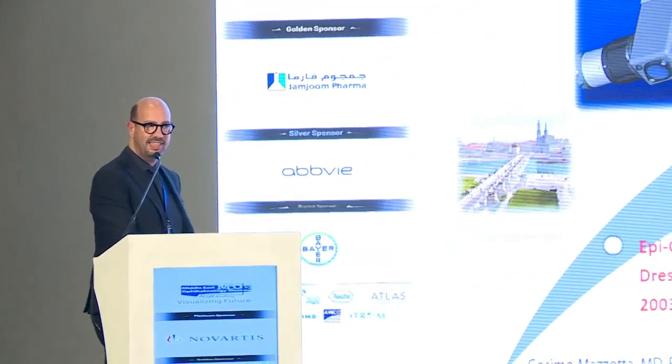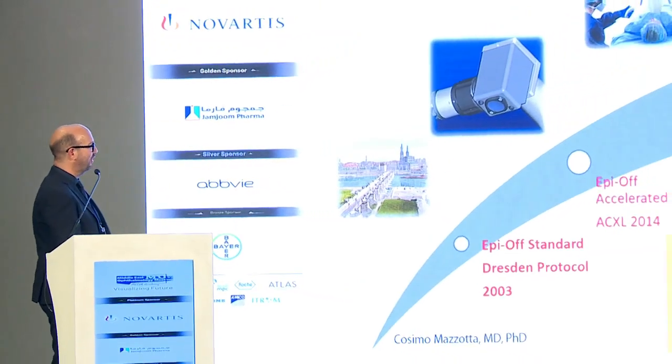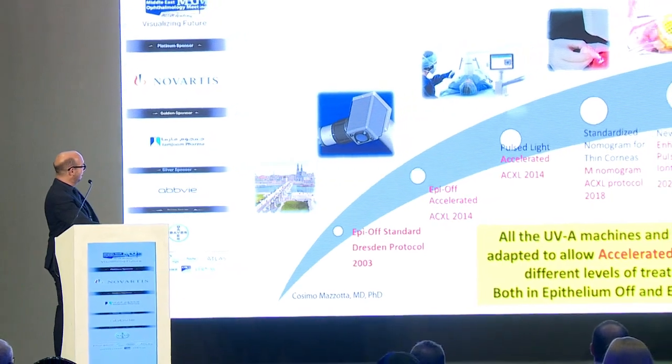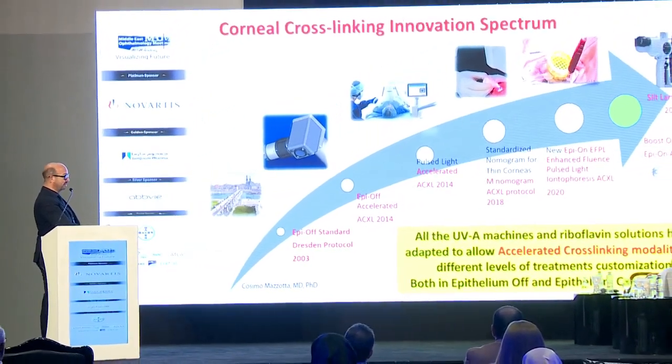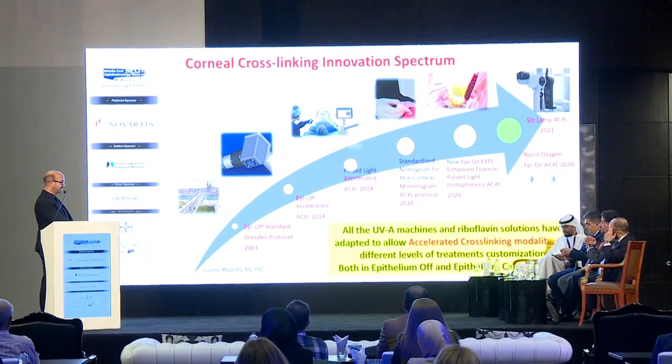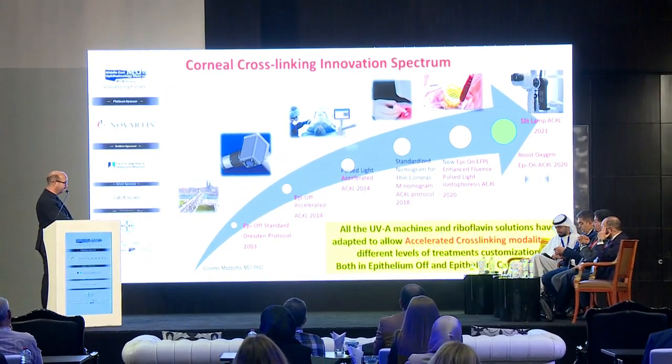We started from the Dresden Protocol in 2003. I personally introduced cross-linking in Italy in 2004 after a fellowship in Dresden with Professor Spoerl. Then Avedro developed in 2014 the first accelerated protocol with 30 milliwatt, introducing pulsed light treatment.